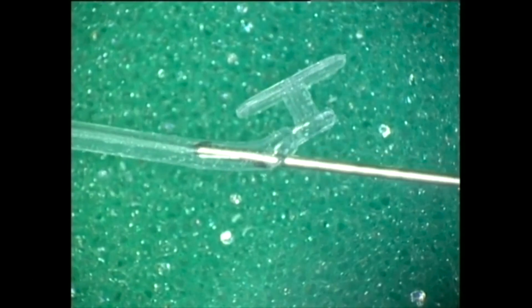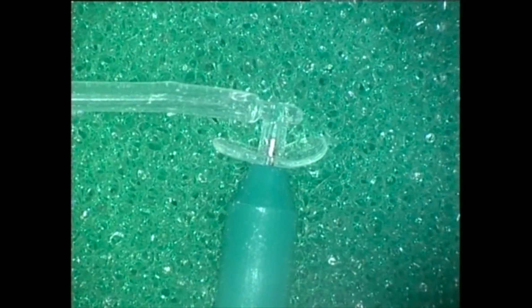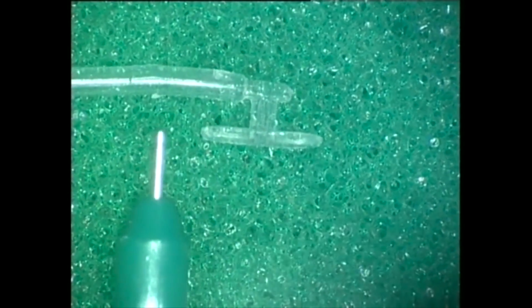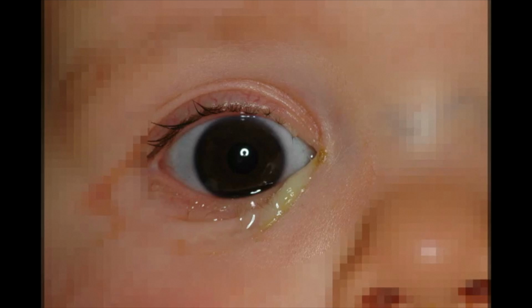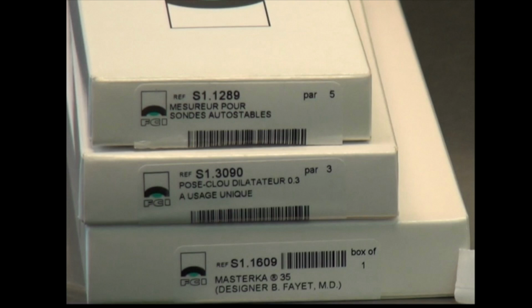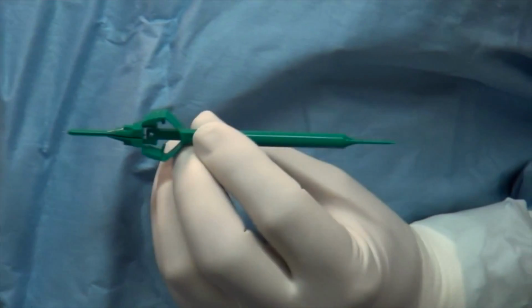The stents for the MASTERKA push type of nasolacrimal intubation come in three lengths: 30, 35, and 40 millimeters. The MASTERKA provides an excellent alternative for managing both early as well as late and very late nasolacrimal drainage obstructions in children. However, an initial diagnostic probing on the operating table is an essential step prior to inserting any stent.